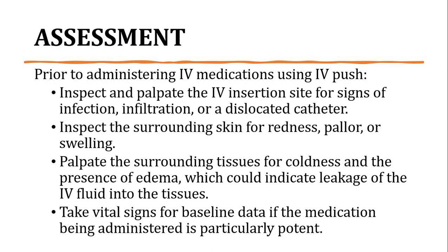Then, inspect the surrounding skin for redness, pallor, or swelling. Palpate the surrounding tissues for coldness and presence of edema, which could indicate leakage of intravenous fluid into the tissues. Yun nga po kapag na-misplace yung IV sa client, hindi sa blood circulation, hindi sa blood vessel, mapupunta sa tissues which cause the edema. Kaya po kailangan i-relocate siya, yung IV, or i-replace sa client para malagay sa blood system to administer the medication.